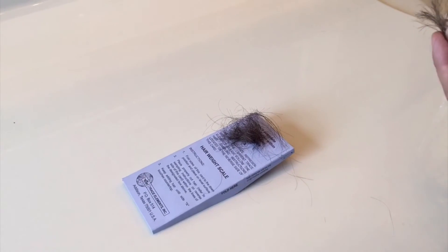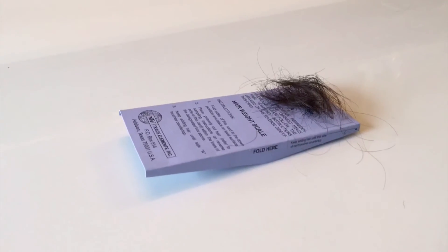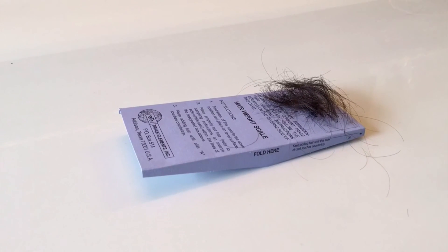We'll be collecting the hair on the scale, right here on the tip of the scale. When we add the rest of the hair and it tips, that's when you know you have the correct amount to put into your envelope.